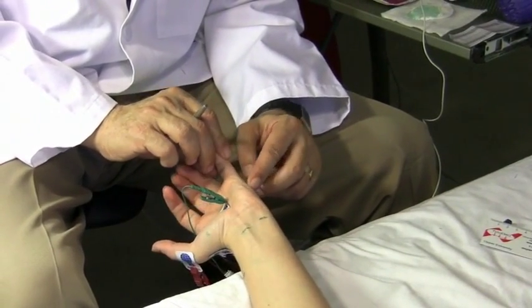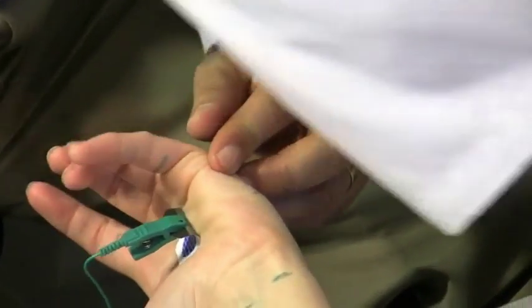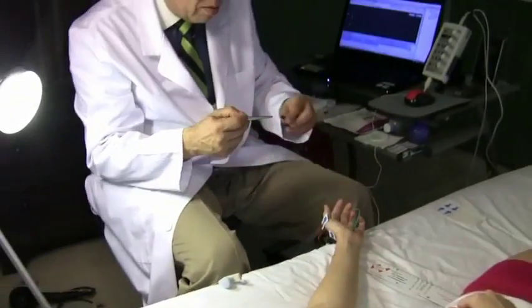Spread your fingers. And here I see it, I don't know if you see it well here. The muscle bumps up here, and I put it across here. That means that's where I'm going to put the surface electrode. I measure 5 centimeters here, and now I know where I'm going to stimulate it. So again, these are my distances because I have good normal values for them.